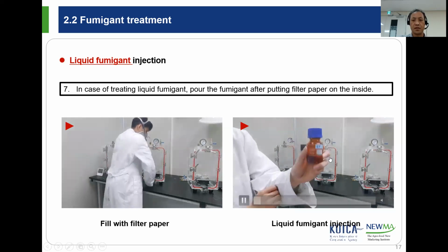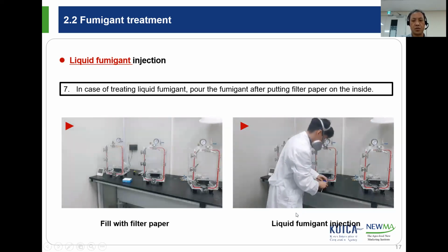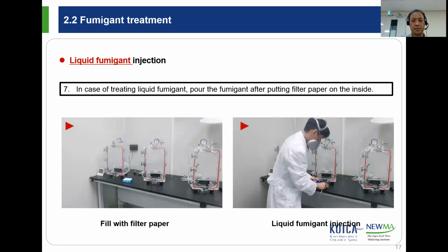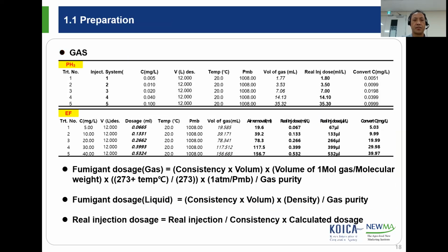This is ethyl formate, it's a liquid. So you have to inject the exact amount of liquid. That's why you have to check this Excel file again.